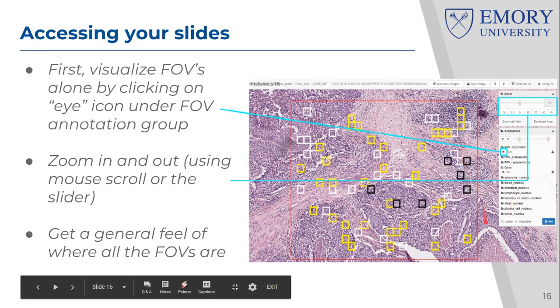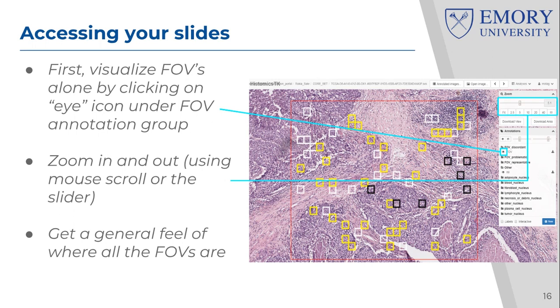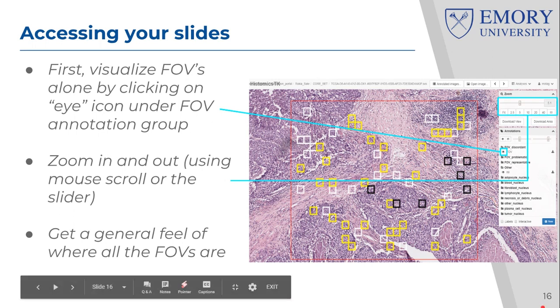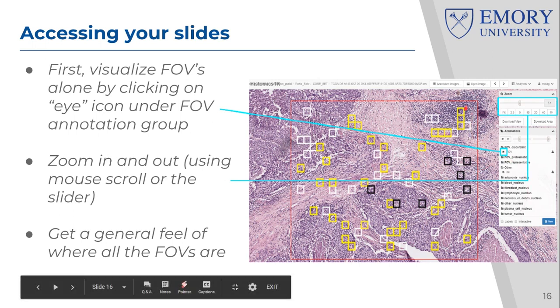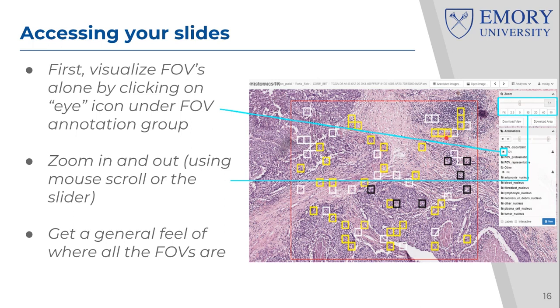Sometimes the computer annotations are very correct, so you barely have to do any work. But it really depends. This is going to take a little bit of time, which is why you only have to do 5 slides in the core set. So if it takes you even 2 days per slide in the core set, that's just 10 days of work to finish your core set. And then for the evaluation set, you only have 6 of these squares per slide, so it's like nothing. So for the core set, don't feel overwhelmed by the number of FOVs, because you only have a limited number of slides that you need to do.